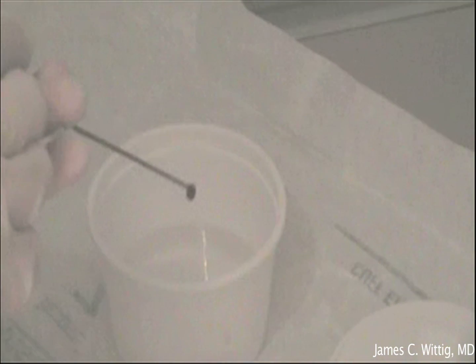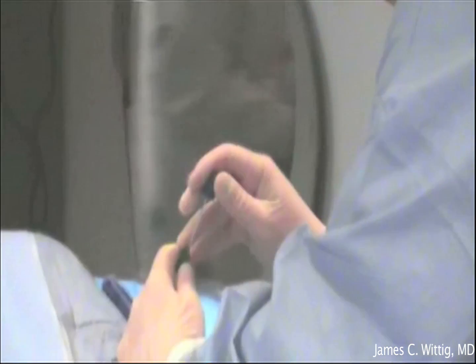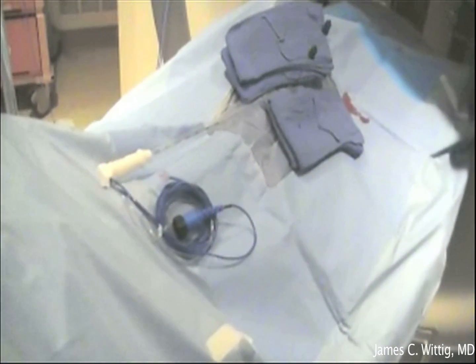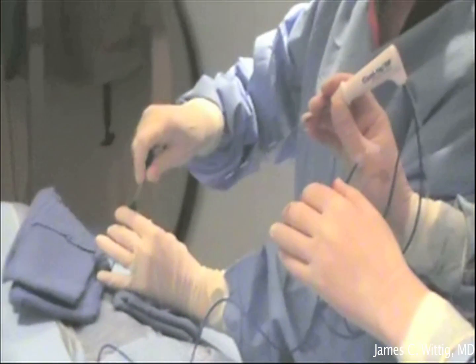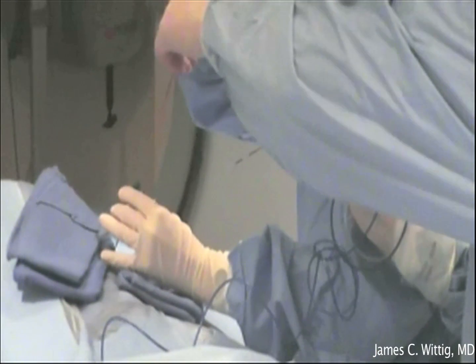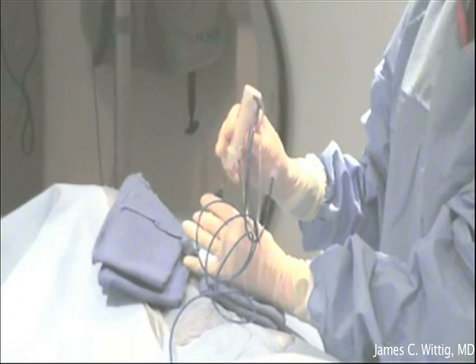The biopsy is placed in formalin and will be examined by a pathologist. Once the biopsy sample is obtained, the lesion can be ablated. The original needle that was placed down to the bone is kept in place, and the radiofrequency ablation probe is placed down the center of this needle into the nidus.